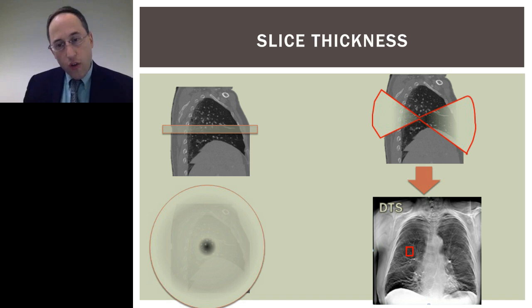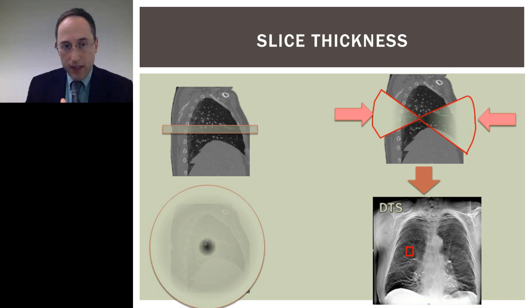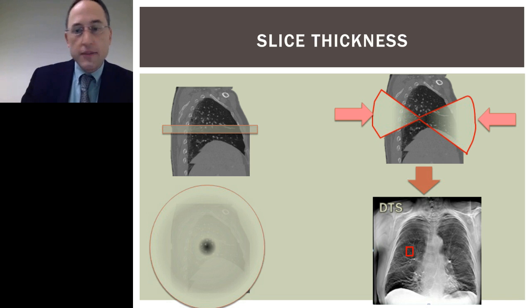If you took all the values inside this area and you summed them together, that would be the intensity of the pixel that's indicated below. So you have a very high contribution from pixels that are in the focus plane. But as you move from the focus plane, your contribution decreases and decreases as you move further away.